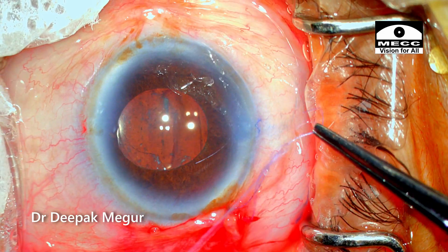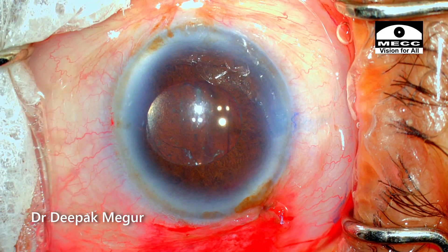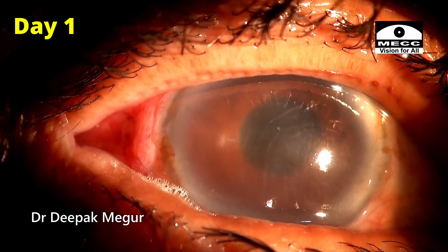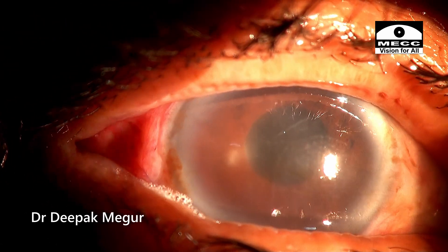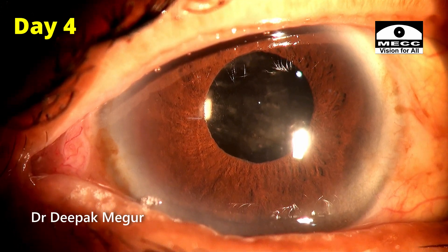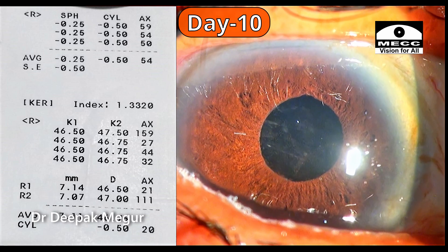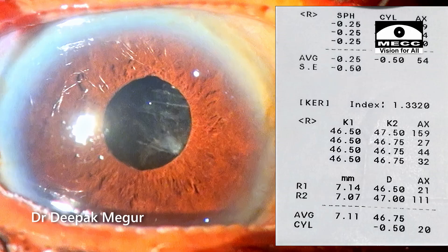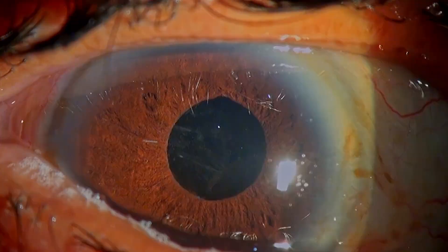The throws would be 3-1-1 before the final knot is put. On the first day, the eye was quite fiery with a lot of inflammation and corneal edema. It gradually subsided in the coming days, and by the 10th day the recovery was excellent with uncorrected visual acuity of 6/9, with very little astigmatism — and the patient's happiness was quite gratifying.